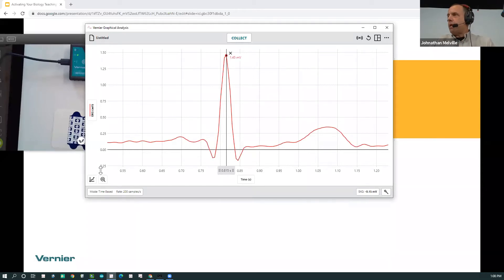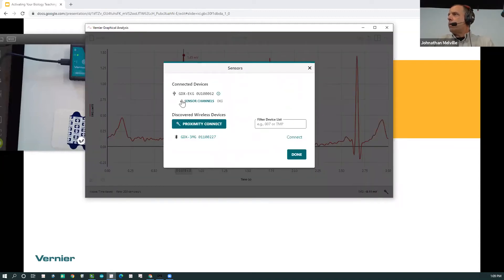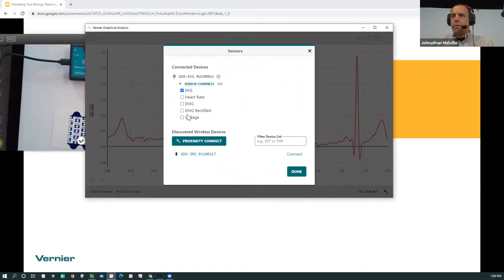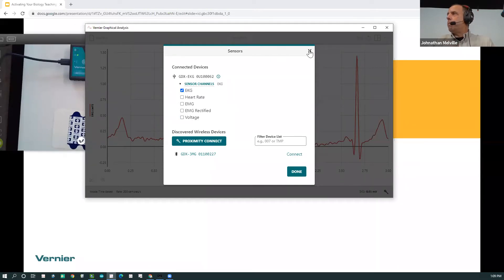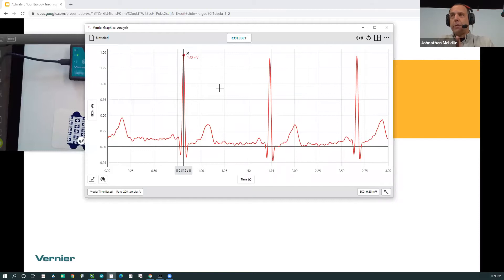This sensor has some really cool key channels. If you go down here to sensor setup, you can see it has channels for heart rate, EMG, EMG rectified, and a voltage channel that applies no filtering. The EKG channel is set up to filter just for EKG, so it gives you a nice clean EKG trace. Does anybody have any questions? I can also show you how to connect wirelessly — you would connect using this dialog. There's also a proximity detect feature where you just hold the sensor close to your device and hit 'Proximity Connect.'